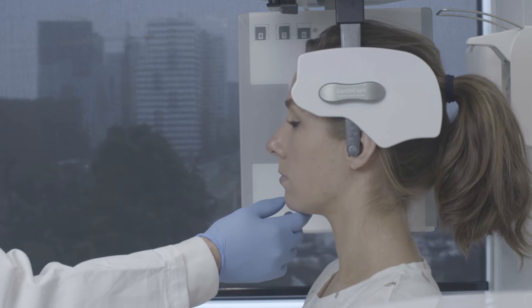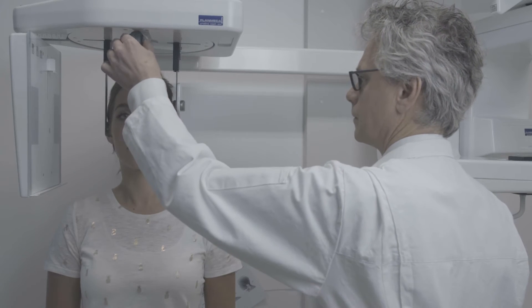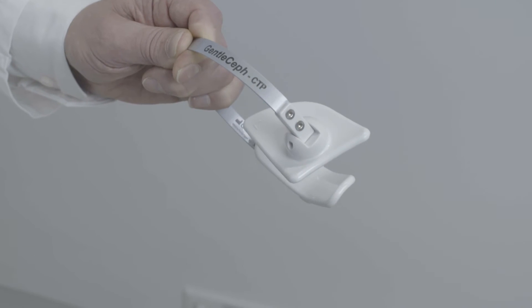We check the horizontal head position and place the nose or forehead stabilizer. We are now ready to place the thyroid protector.